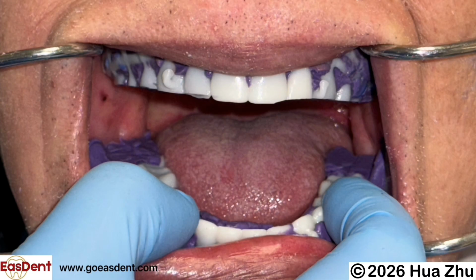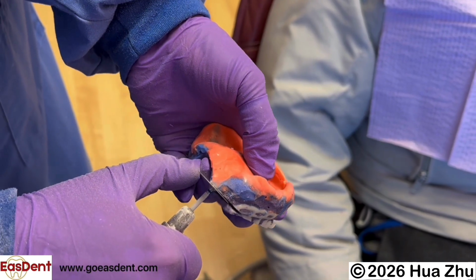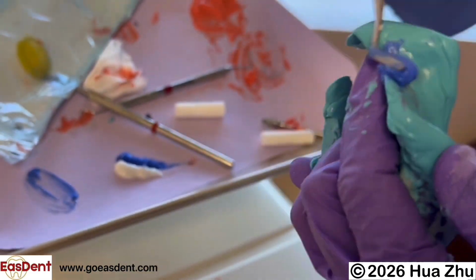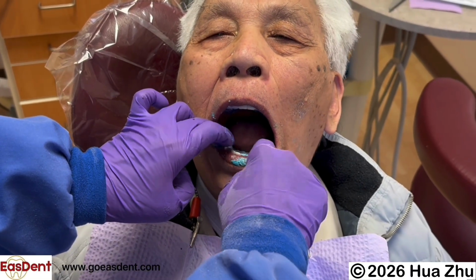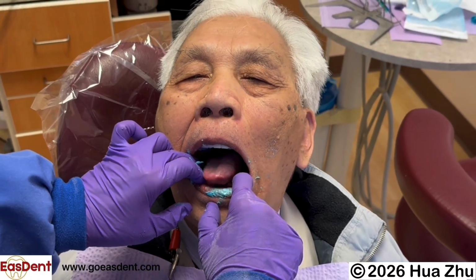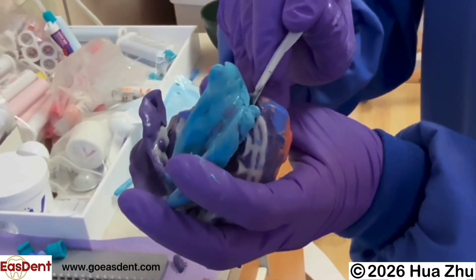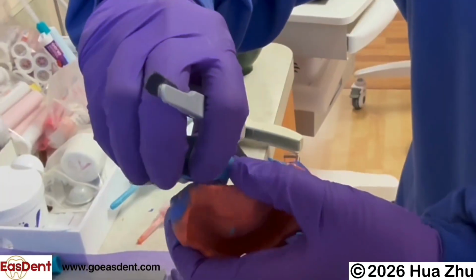If you miss the retromolar pad areas due to maxillary posterior teeth biting into the areas, cut maxillary second molar areas short to give room. Then add heavy body PVS material at the missing retromolar pad area and reseat the tray back to the mouth. After you press the heavy body PVS material in the retromolar pad areas, let the patient bite down and then open to mold the material with functional movement, then bite down and open again. Do not let the patient stay biting down all the time. The newly added heavy body PVS impression material may stick to the maxillary impression material and set together.